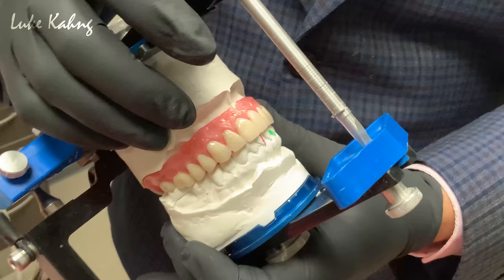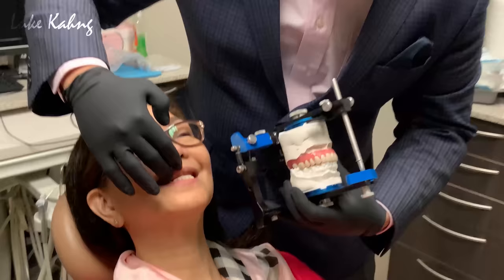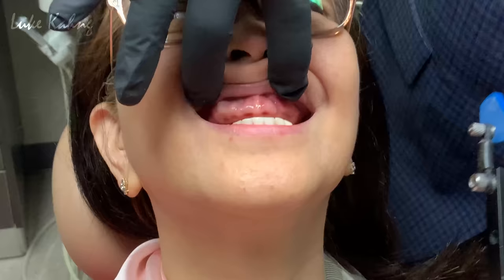Okay, so right now, as you can see, look at her gum shade. It's a little light, right? It's nice and healthy, but it's a little light. So it's definitely not the pink or the red that you see usually in some dentures that are made. That's something that's very important, okay?